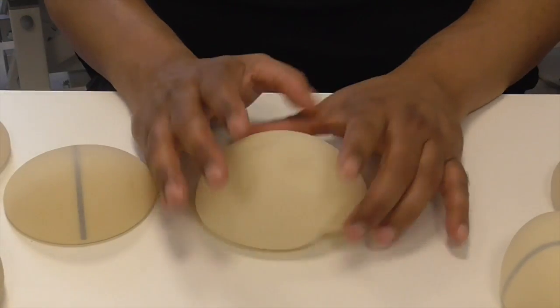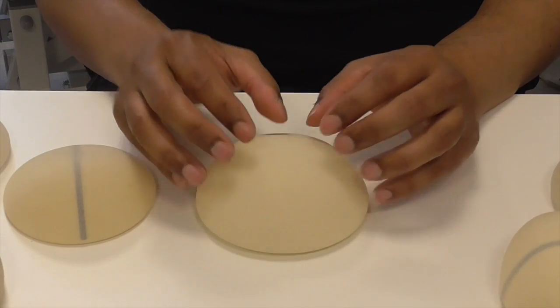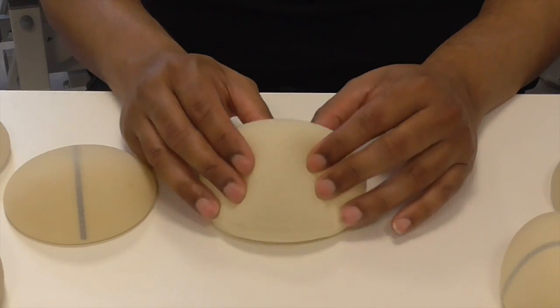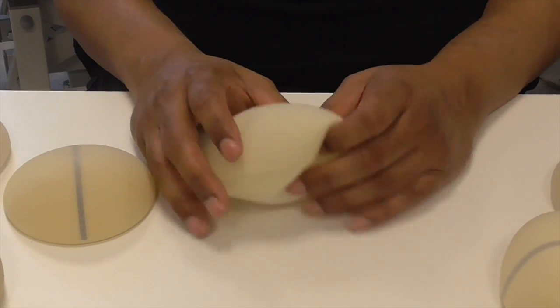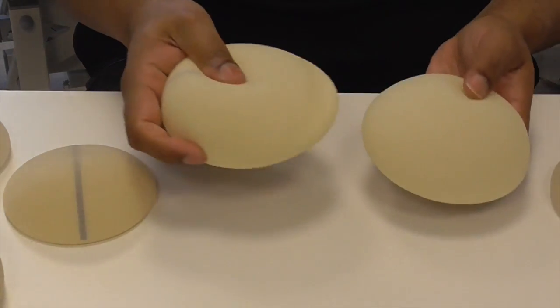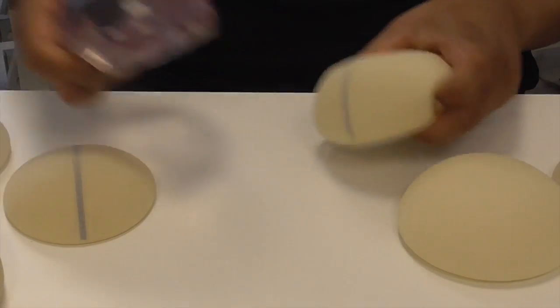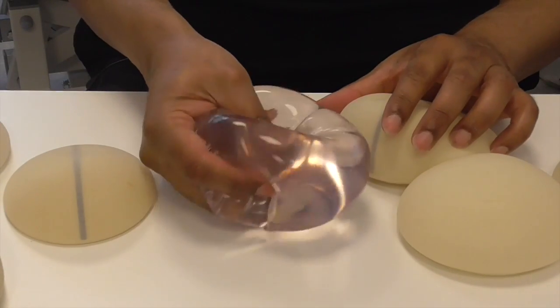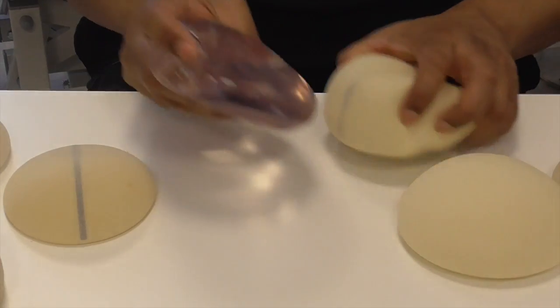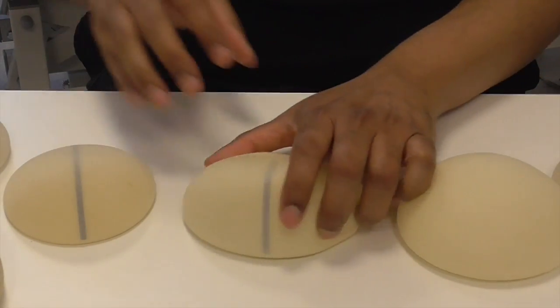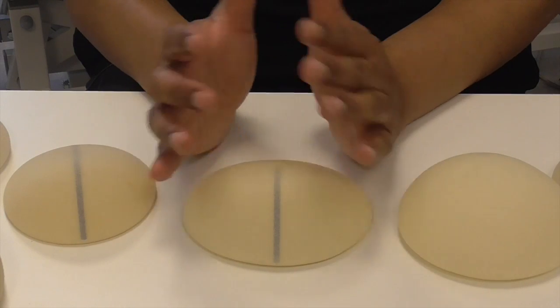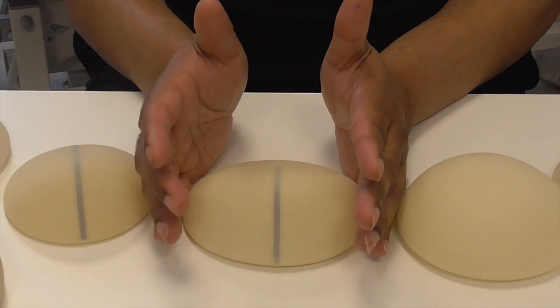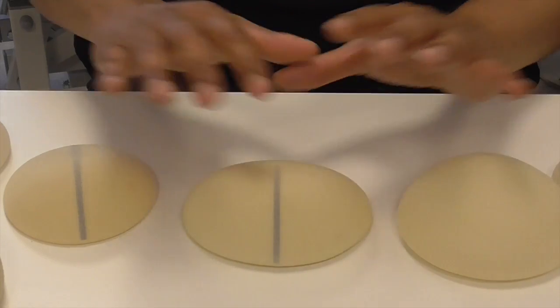The final thing you've got to look at is the cohesiveness of the gel. The gel itself comes in different levels of cohesiveness. This is a bit firmer, that's quite firm, while this implant is quite squishy. One can look at the different cohesiveness because the firmer the implant is, the less rippling you'll get, but it may feel less natural.